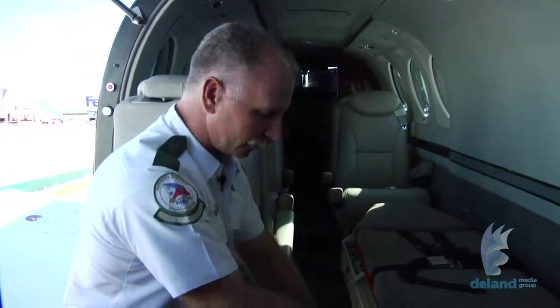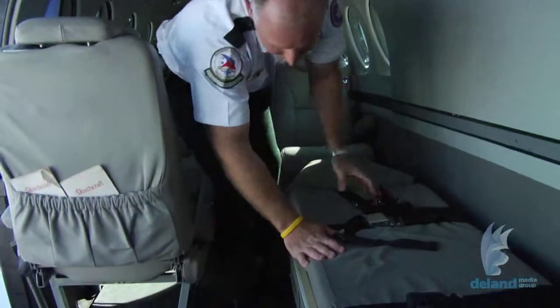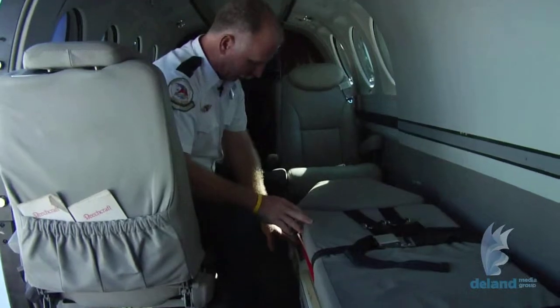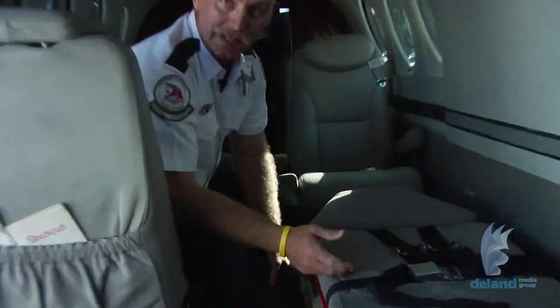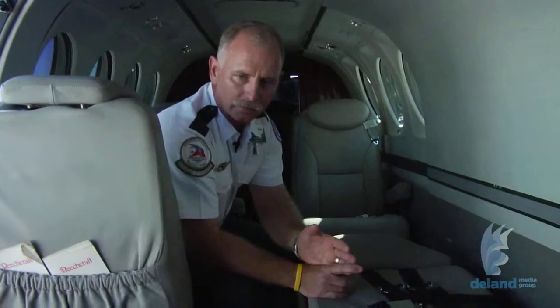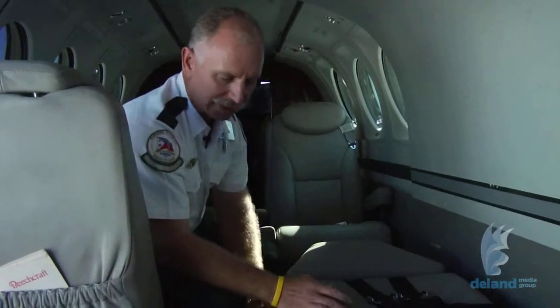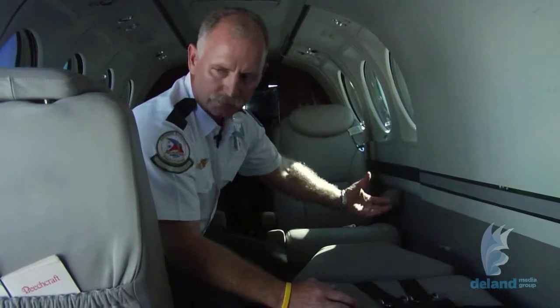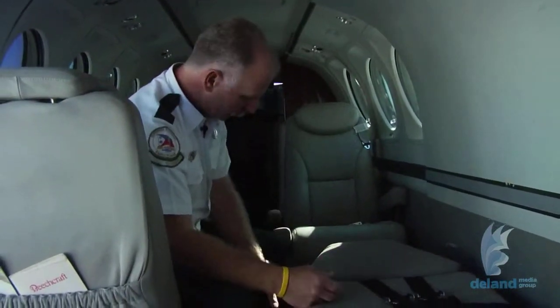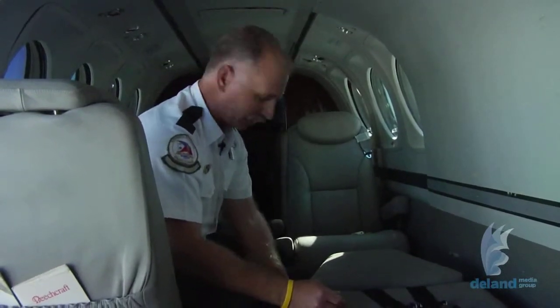We have the pilots turn power on. Once they feed power to the sled itself, then we have, in the front here, a 110 or 115 volt AC, and we have 3 receptacles so that we can plug in IV pumps, IV pump chargers, EKG monitor chargers, ventilator, anything that we need to power with 110 volts. There's an internal inverter that takes the power from the plane and turns it into 110. And we also have a built-in suction, and we also have built-in compressed air.